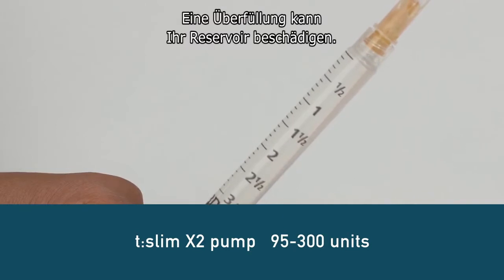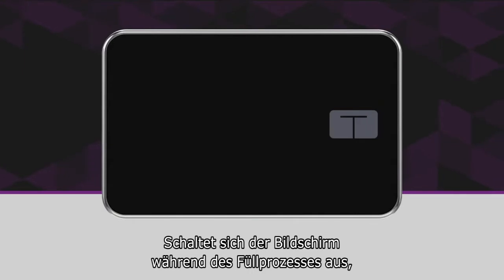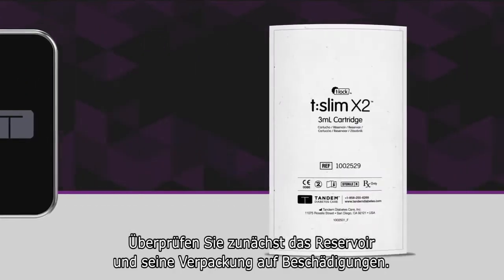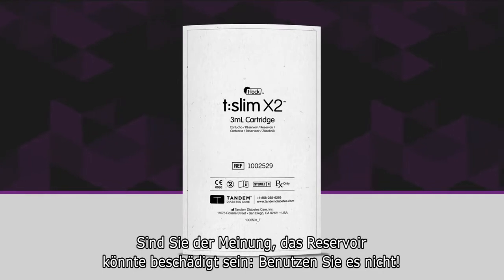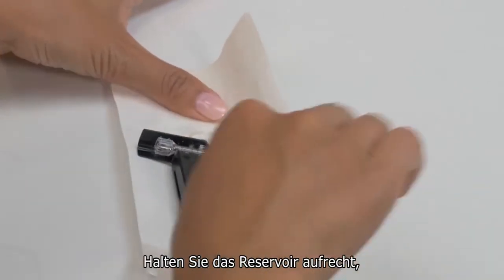Be aware that overfilling can damage your cartridge. If your pump screen times out at any point during the load process, just unlock your pump and it will resume right where you left off. First, examine your cartridge and packaging for any visible damage. If you suspect the cartridge may be damaged, do not use it. Now open the package and remove the cartridge.